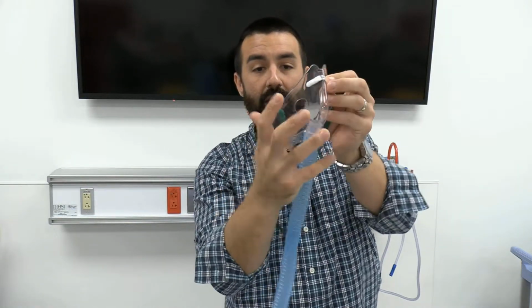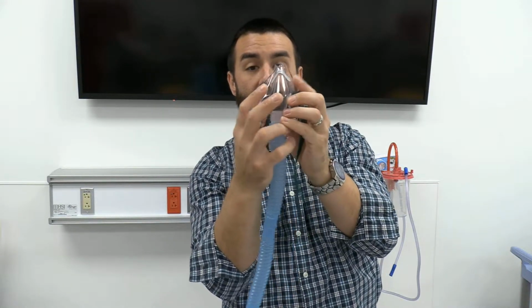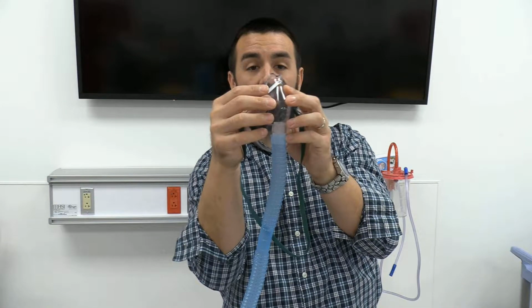So we've got the aerosol face mask. You put that on their face. You've got the bigger hole so you don't get a bunch of resistance or anything like that. You can contour that piece of metal under their nose.